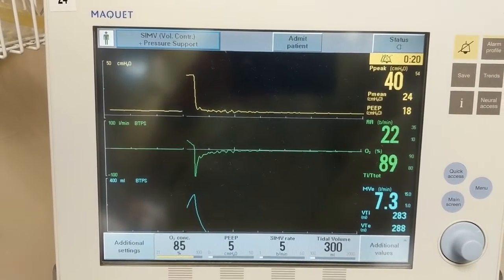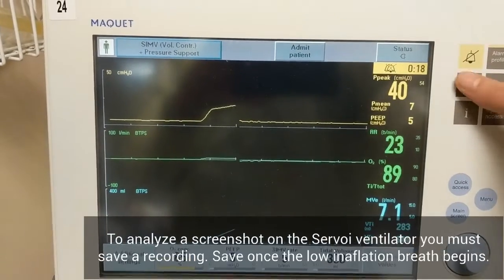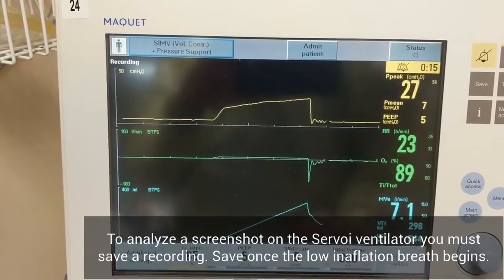With the Servo-I, you can't save a screenshot easily — you have to record it. So once the maneuver starts, hit the save button to start the recording.